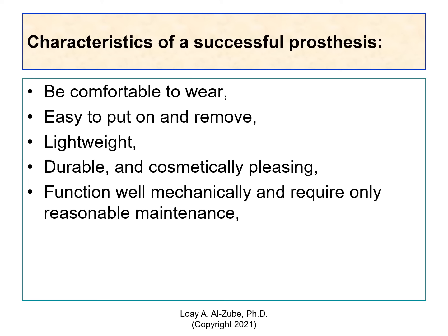It's very important. We need to empathize actually with the psychological situation of the subject. Really, it's really important, because if they don't like it, they're not going to use it, and then everything will fail. Function well mechanically, and we are good in that. That's our field. And when you say function well mechanically, you need to look at the kinematics and kinetics, right? Parameters that we measure usually.